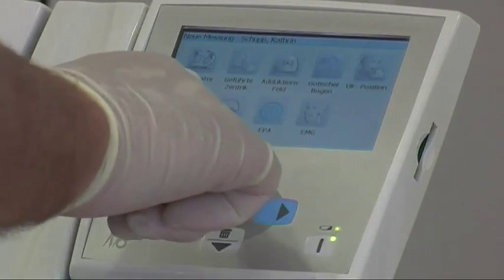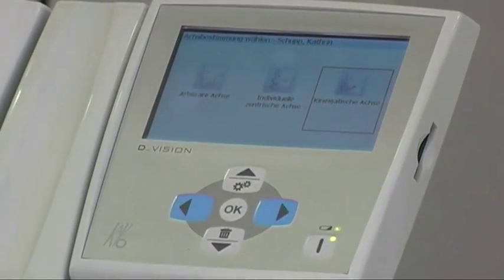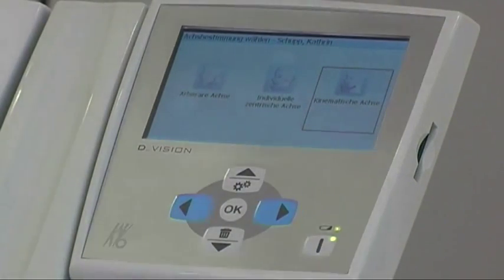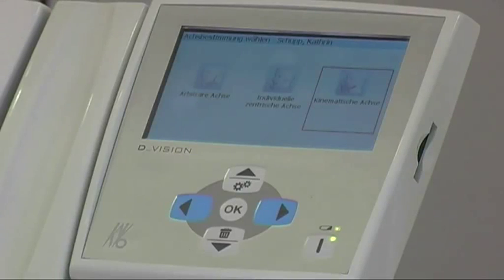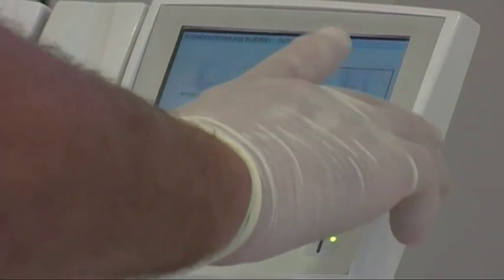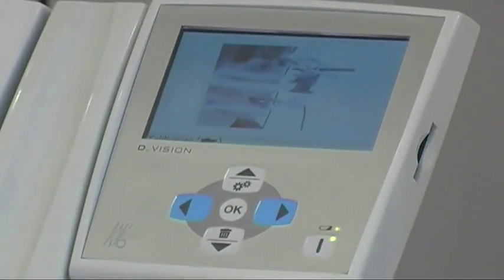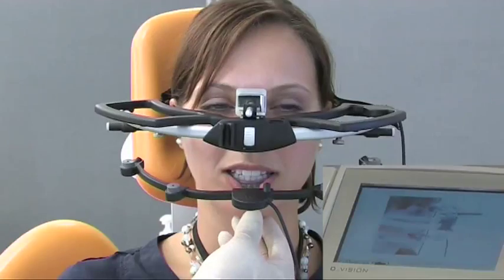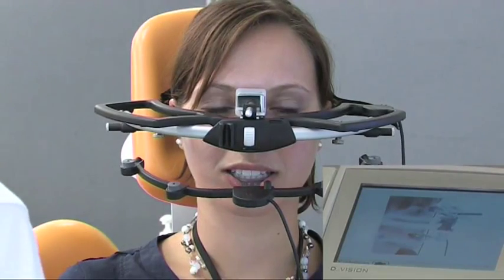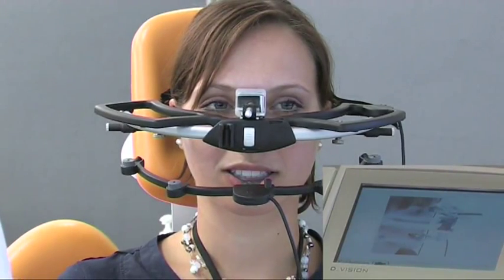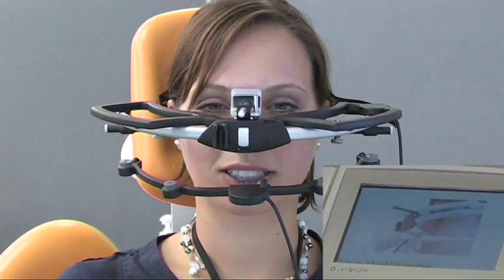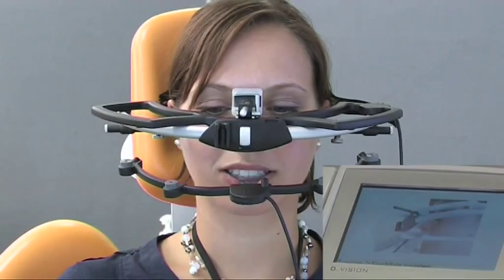We start the movement analysis and first we have to choose a reference axis. For this purpose, the kinematic axis has proved particularly reliable as this is calculated from physiological movements. Please close.